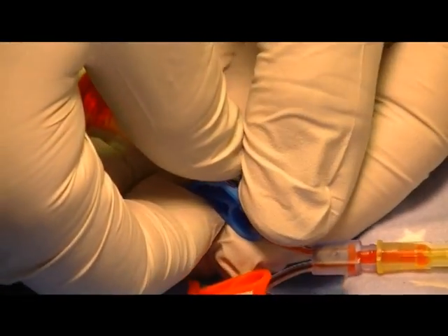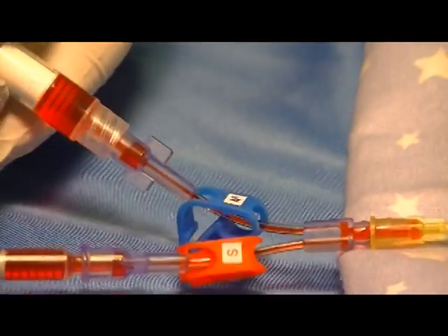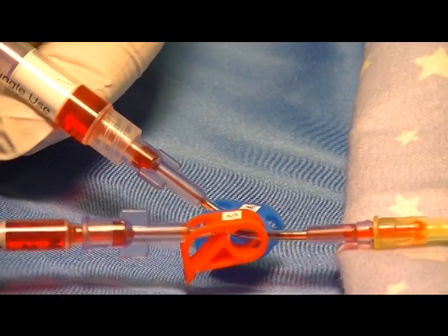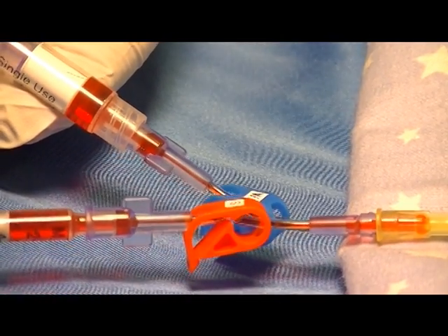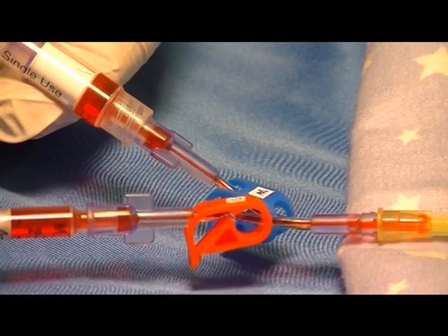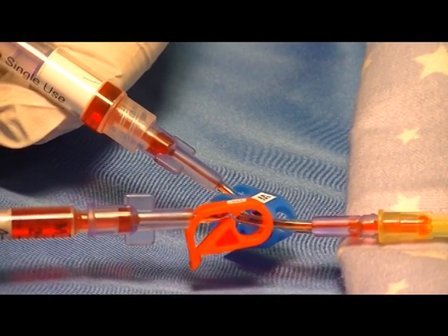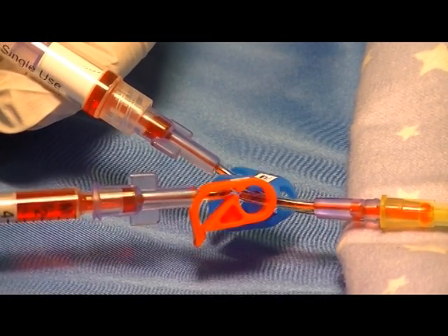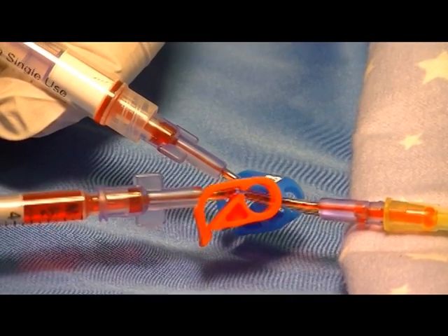Again unclamp the waste and give the waste blood back to the patient very slowly over a 30 second period. Note that there is no air in the waste that can go back into the patient.